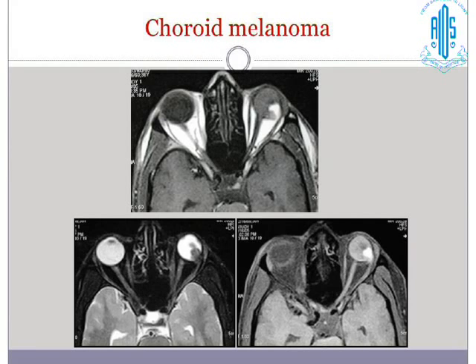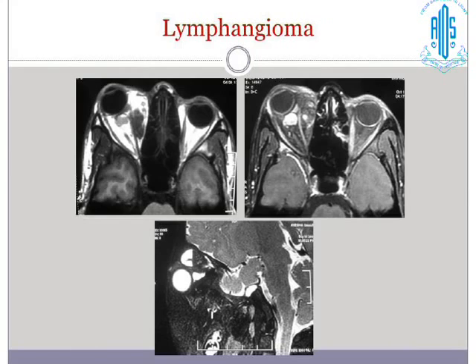Melanoma, as we discussed, MR picks up melanoma extremely well, and the bright signal on T1, dark on T2, this is a signature, the melanin signature for an MR. So on a T1 weighted image, all that which is bright could either be a fat or a hemorrhage. So on a fat suppression image, here you see that everything else is suppressed, the fat is suppressed, and you see a bright tumor which is enhancing.